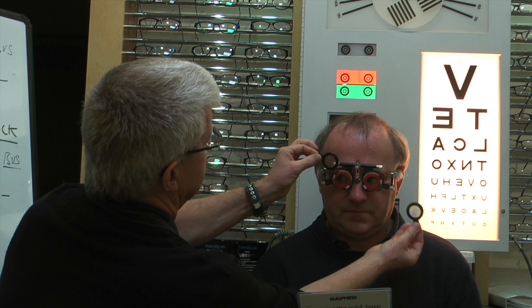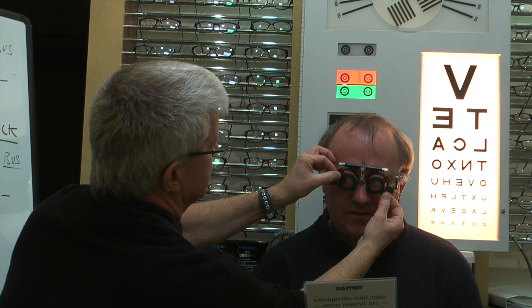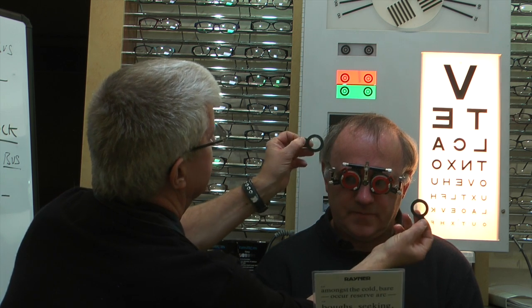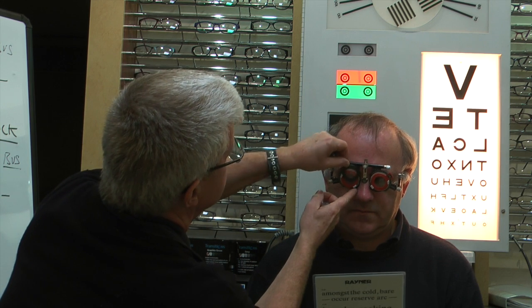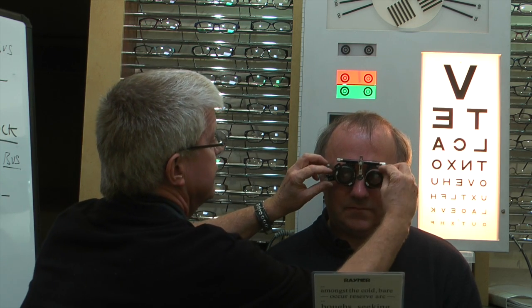Offering up a plus 1.50 — does that make it better? Yes, that's much better, I can read all of it easily. I'm going to put the plus 1.50 into the trial frame. This will blur his distance vision, so we're only interested in reading now.